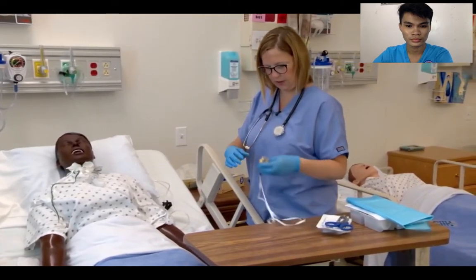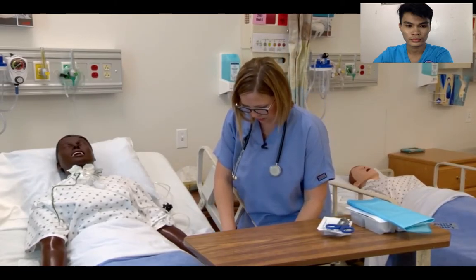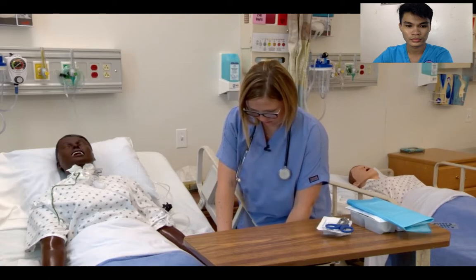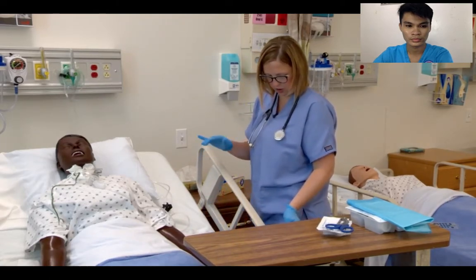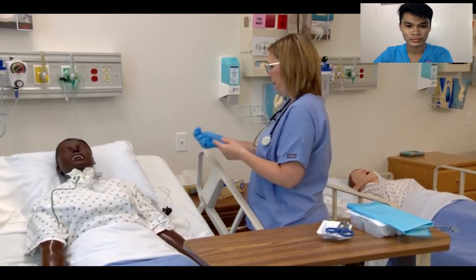I'm also going to put this thing on your finger here, the pulse ox. Let's see how your oxygen level is doing right now. Yeah, looks like we could use a little bit of suctioning. Alright, I'm just going to get my stuff all set up.